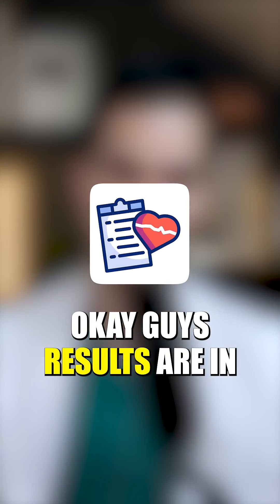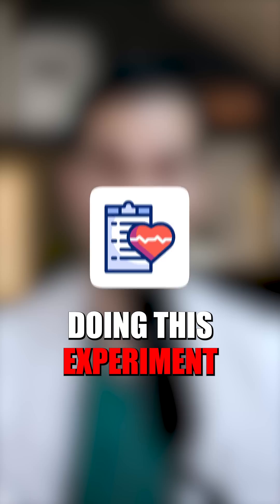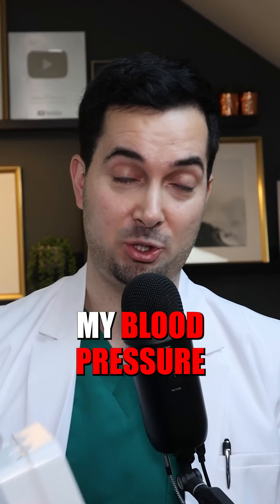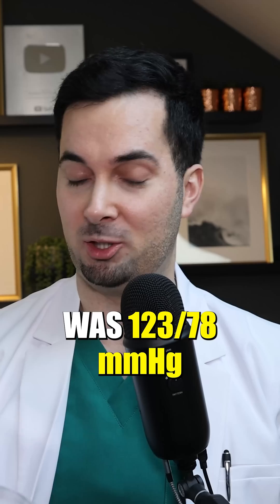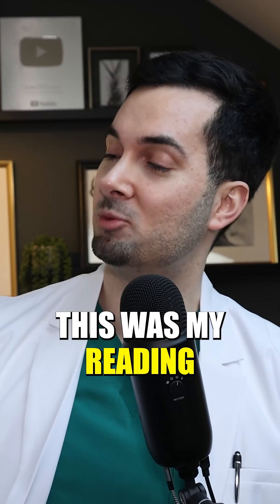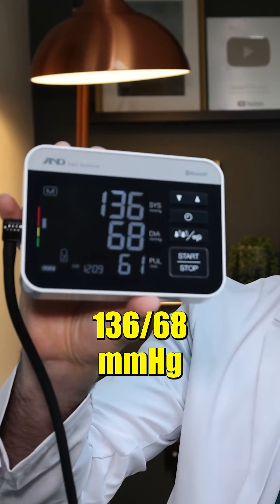Results are in — I've really enjoyed doing this experiment. Remember, the baseline when we did the blood pressure correctly was 123 over 78 mmHg. With the arm unsupported and the cuff not at heart level, my reading was 136 over 68, so you can see there has been a significant increase in the systolic reading.